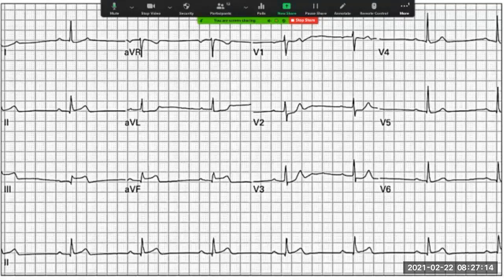The one thing you guys must remember, that classic thing that you learn in medical school, left-sided chest pain, going to the jaw, going down the arm, is not actually that common. We don't get it that much. And if we do get it, we're quite surprised because it doesn't happen that often, okay? So we know we've got something going on in the inferior lead. So we don't stop now. Okay, everything's fine, we know what's going on. We've still got to look at everything else, right?